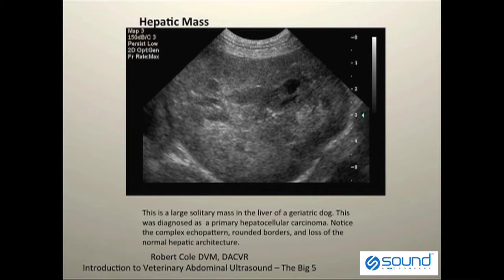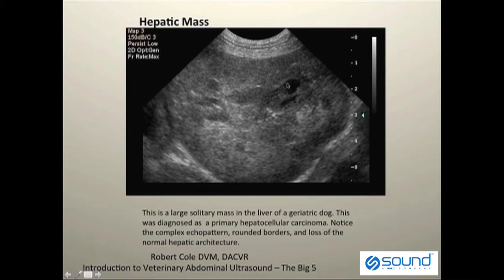Lastly, we have an example of a hepatic mass. This represents a uniformly enlarged portion of the liver that has lost all normal hepatic architecture. It has what's referred to as a complex echo pattern, as indicated by the hyperechoic and hypoechoic regions, as well as a small area that is anechoic within the central portion of that liver. Although not definitive, this is typical of a primary hepatocellular carcinoma.